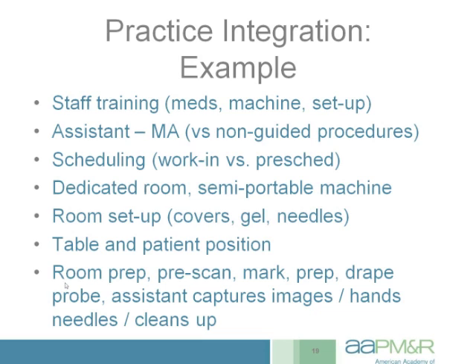We basically have a very basic protocol at our practice. We make sure the room is cleaned and ready to go. Everything's out that we're going to need: probe cover, sterile gloves, the needles we're going to need for that particular procedure. Patient's name is already in the ultrasound machine. Preferably, I already like them on the table and in position.